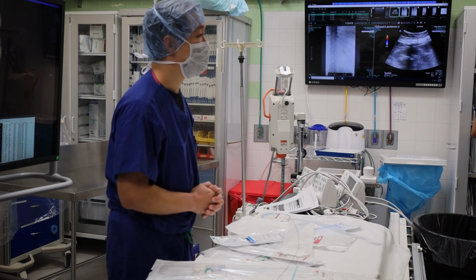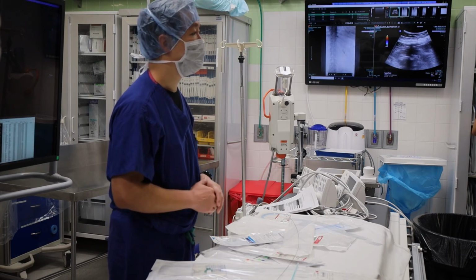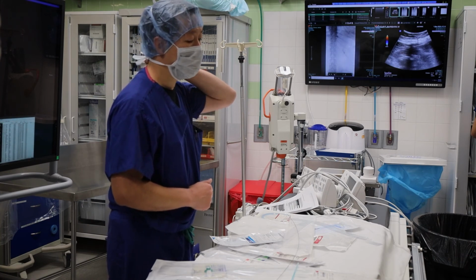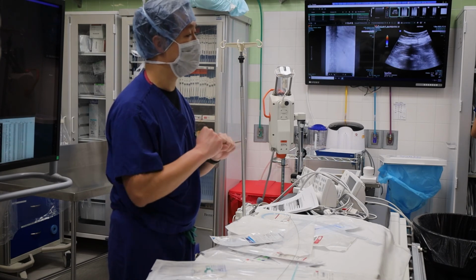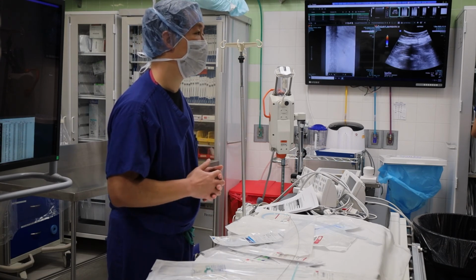Yeah. If you have a purulent kidney, do you want to drain as much of that out? Do you pull as much of that purulence out, or you just kind of leave it? I think it depends on the doc. Some people want to just get it out as much as possible. Some other people believe that if you stir it up too much by yanking it out, you're actually introducing bacteria to the body. So it depends on the person.